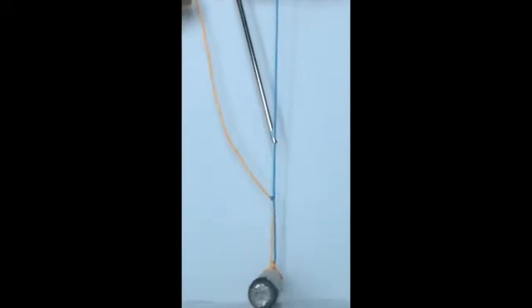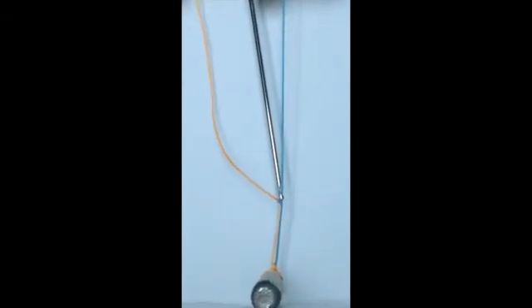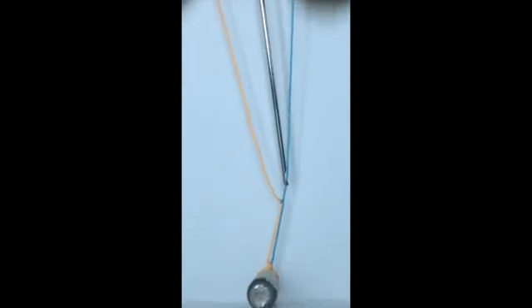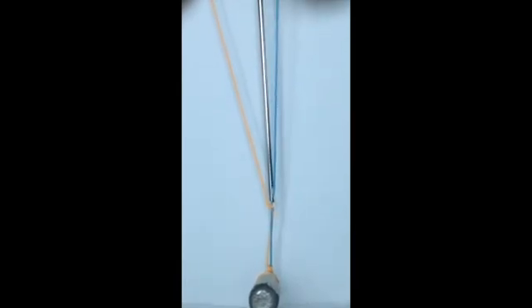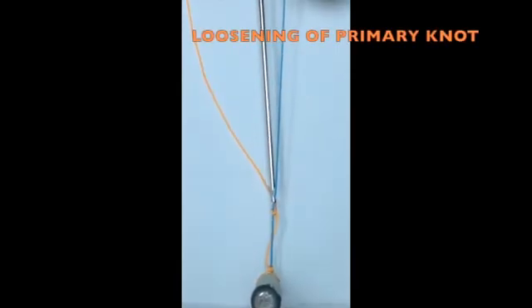If tension is placed on the blue limb or the post limb, it may cause obstruction in knot delivery and more importantly cause the primary sliding knot to loosen.